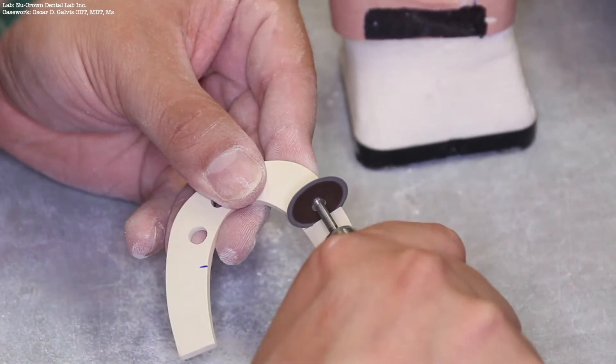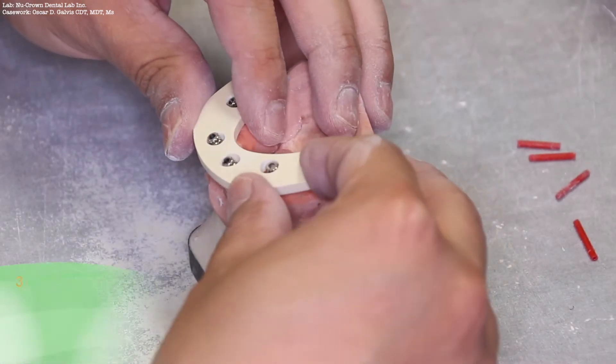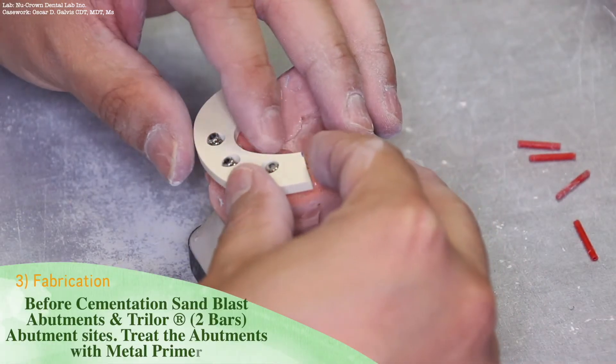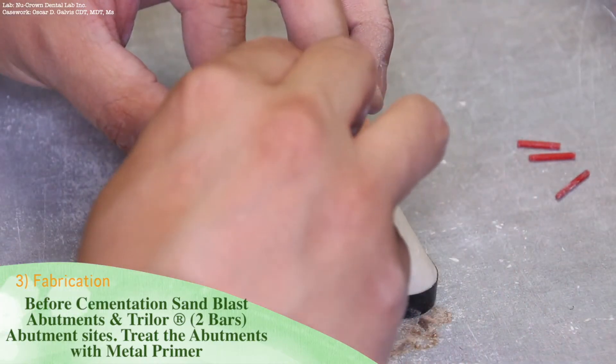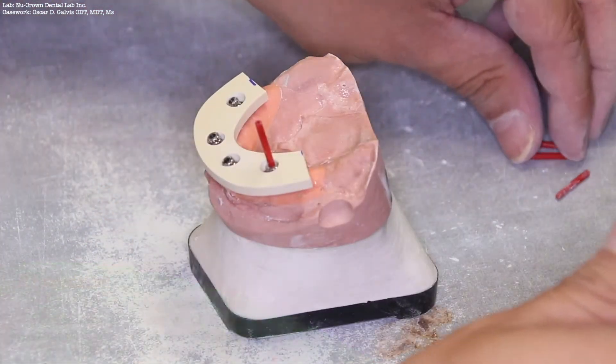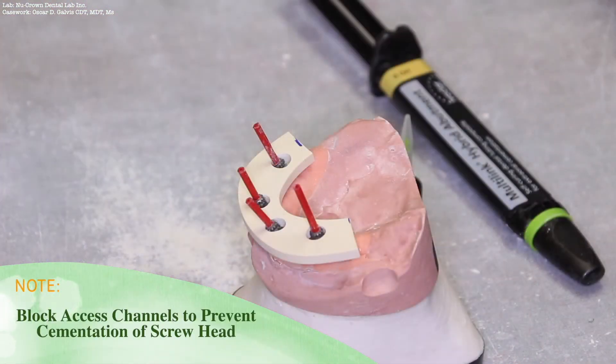Before cementing the Trilor substructure to the titanium abutments, be sure to sandblast the titanium abutments and the Trilor at 2 bars pressure. Treat the abutments with metal primer as well. It is also good practice to block the access holes to prevent cementation of the screw heads.